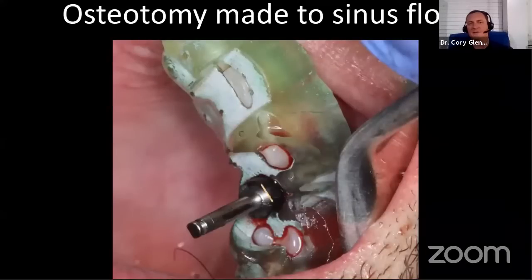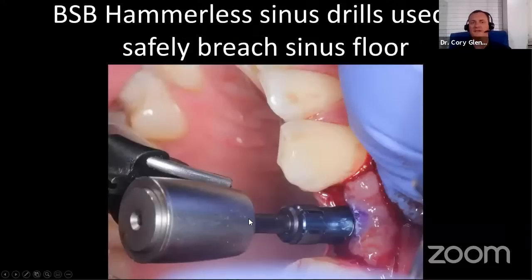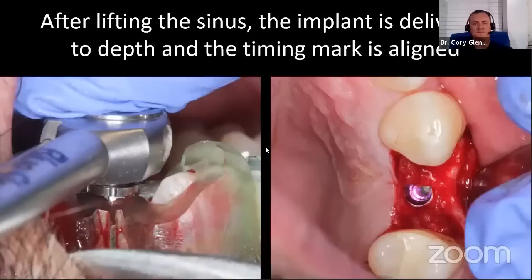The osteotomies are done. And again, we had to do a sinus bump here, so we didn't go all the way to depth. We just went to the sinus floor. And then we switched over to the safe-ended sinus burrs. These allowed us to breach the sinus floor and get access to the membrane without perforating it. It's a really dummy-proof kit. We have a guided version too, although I was using the non-guided this day.